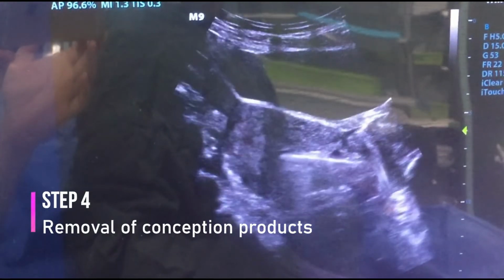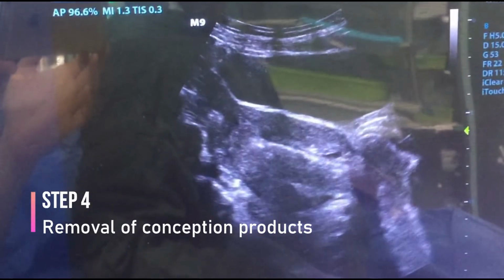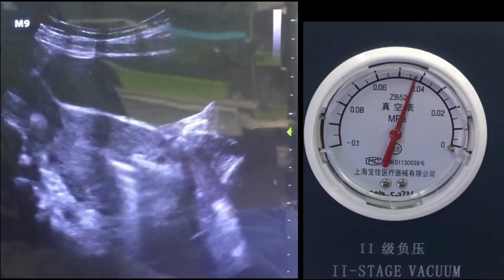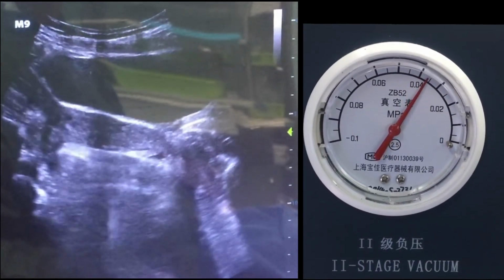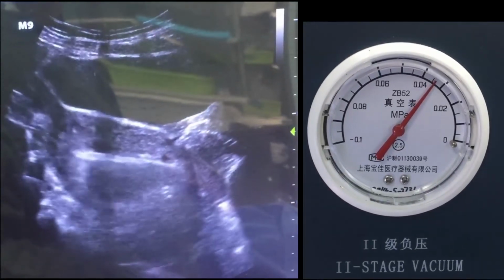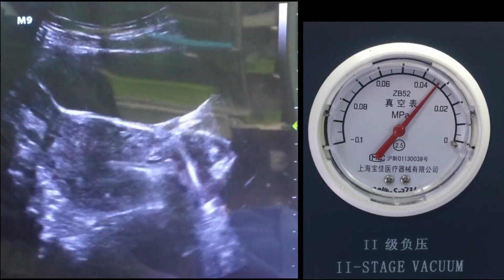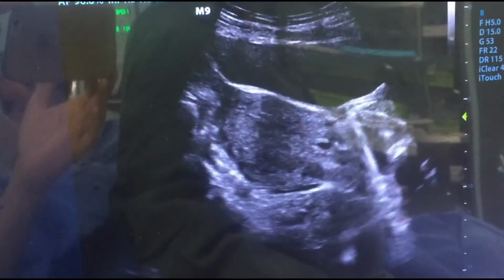Step 4. Electric vacuum aspiration was carried out 24 hours after trophoblastic microcirculation occlusion treatment. In the first round of suction, the suction pressure was controlled at 0.04 megapascal. The deciduous tissue in the upper and middle uterine cavity was aspirated. This was followed by the aspiration of deciduous tissue from the lower back wall of the uterus.